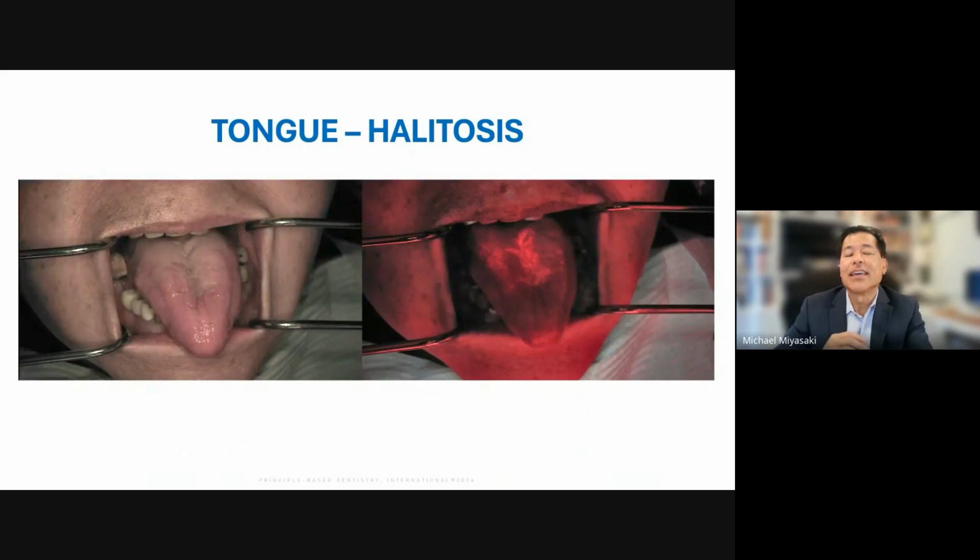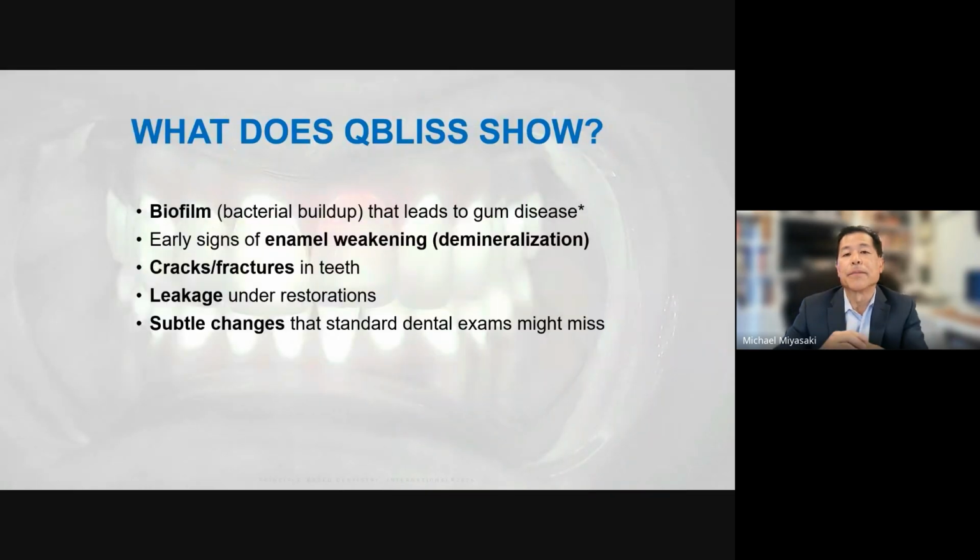That's not good. And then if you want to use that camera and have the patient stick their tongue out, or you can pull the tongue out, take a picture, and if their tongue shows up red, I was just talking to a patient about this today. I was just saying in all those nooks and crannies of the tongue, there's a lot of bacteria that can get trapped in there, and it can cause bad breath, but it also just harbors bacteria. That's not a good thing.